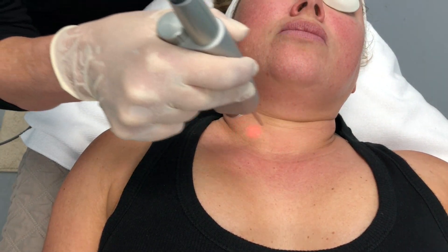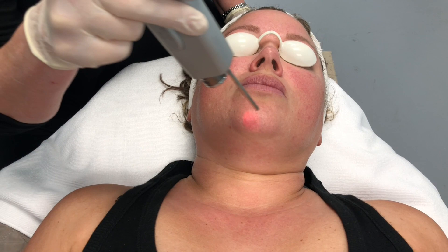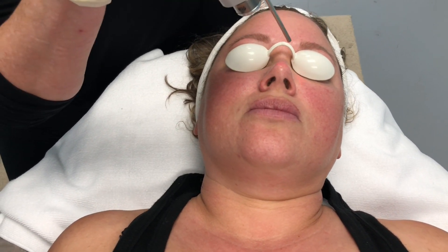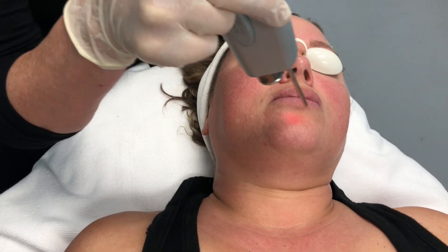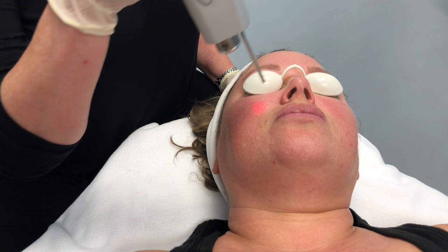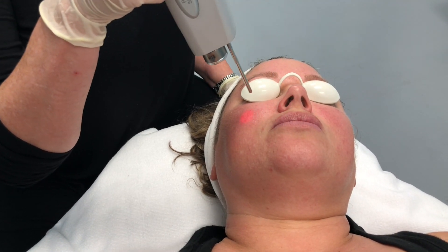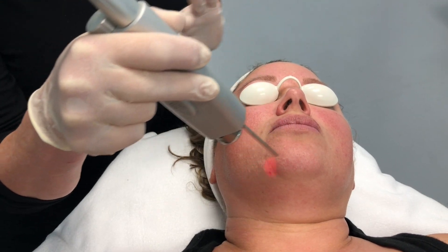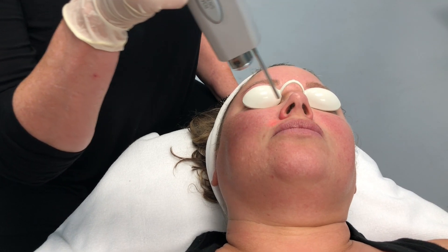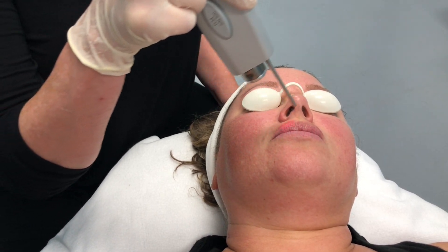You're going to do this all over the chest, neck, and face. I like to go right over the lips with this as well. About eight passes over the entire chest, neck, and face area. This really helps with redness in the skin — not immediately, as while you're doing the treatment and putting heat into the skin it will look more red, but over the next few days it really helps to tap down the redness.